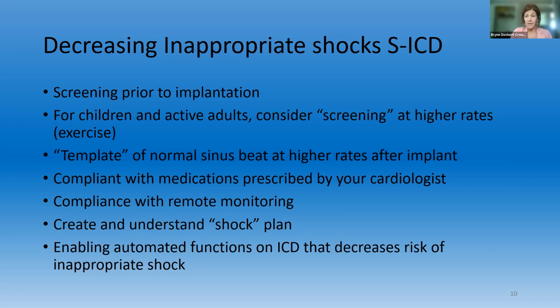Remote monitoring is very key. We can see things that look concerning before anything were to happen. So it's very important that you keep your remote monitoring plugged in and make sure that you come in contact with it at least once a day. We can prevent a lot of things beforehand with remote monitoring.